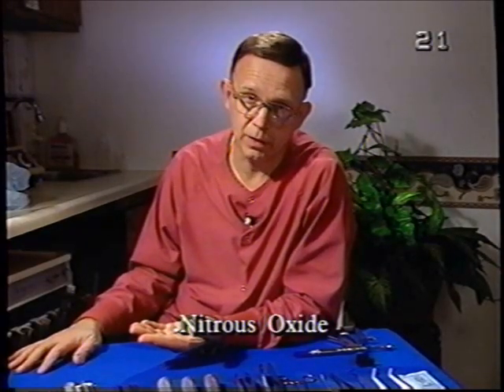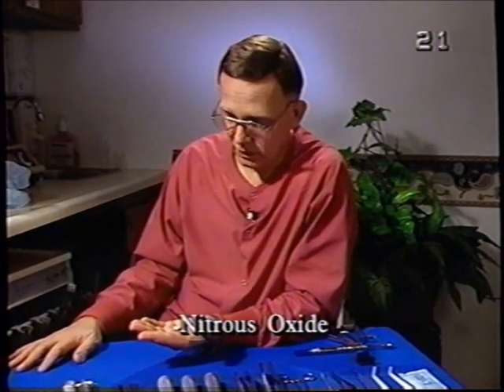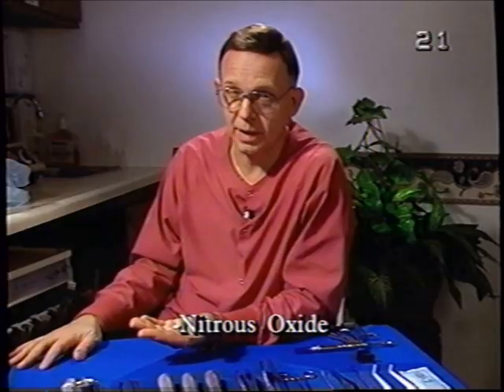So in addition to these oral medications, we will also put nitrous oxide on the patient, somewhere from 30 to, say, 50%. Actually, we don't have the ability to titrate as you would with IV sedation, but in a sense we can, because we titrate with the nitrous oxide.